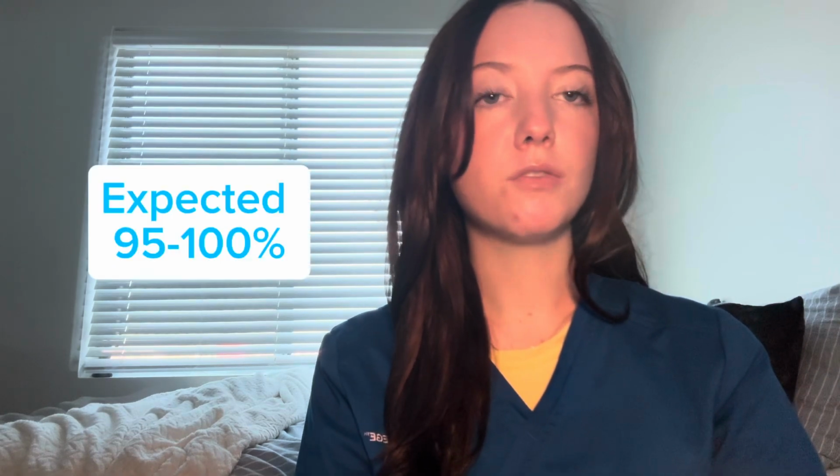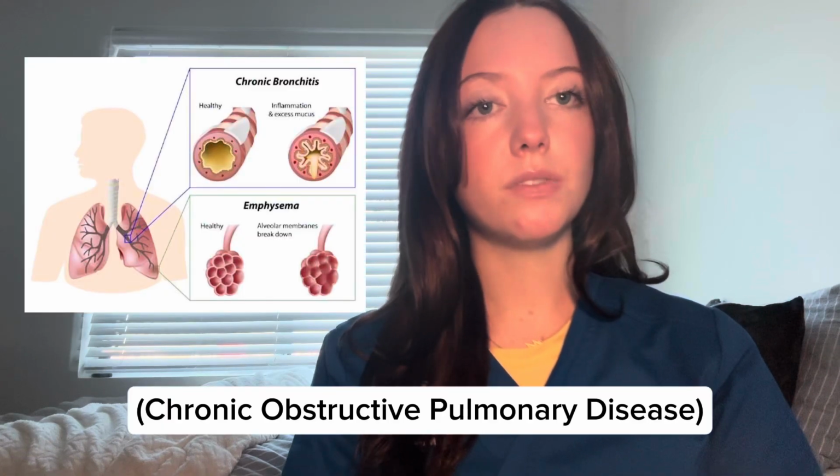Your body relies on a certain amount of oxygen to work correctly. When these levels drop too low, it can cause serious health complications. Oxygen is measured in percentages. An expected level would be 95 to 100%. However, some patients, like those with COPD, may have a different expected range. Those with COPD have a typical oxygen saturation level of 88% to 92%. So it's important to note that levels can vary from person to person.